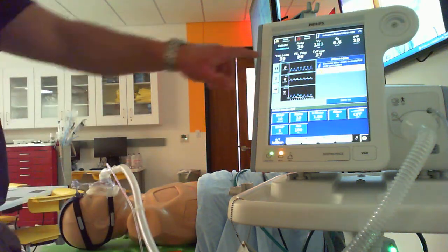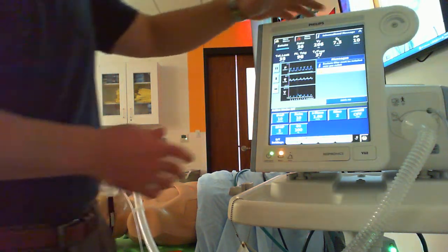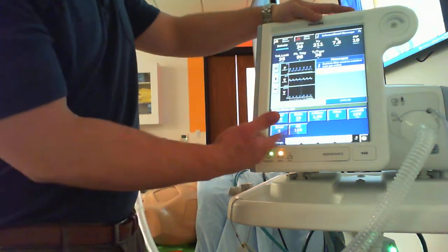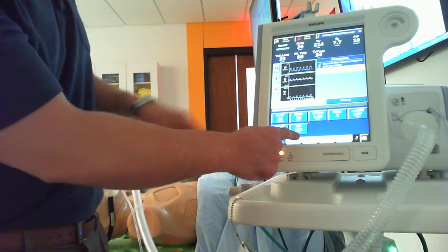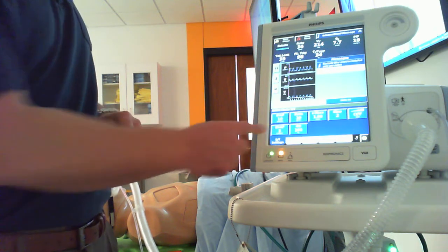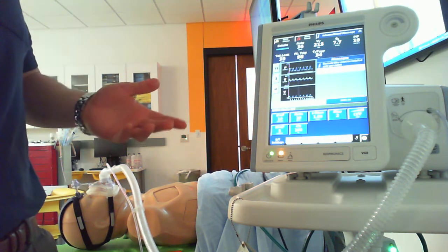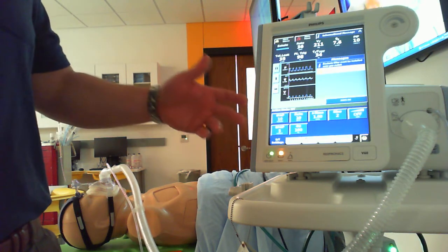So I have an appropriate leak here right now. It's not spraying him in the eyes or anything like that. Right now, I'd be looking at their pulse oximetry to make sure my EPAP and FiO2 are appropriately set. I'm already on 100%. Once again, I know this is really blurry. I'm already at 100% and EPAP of 5, so why would I go up on my EPAP? Well, at the bedside, right after initiation, that would be if I couldn't reach my oxygenation goal.